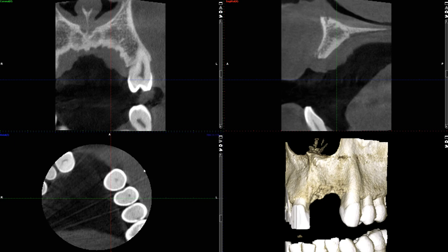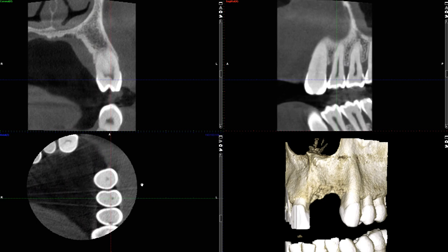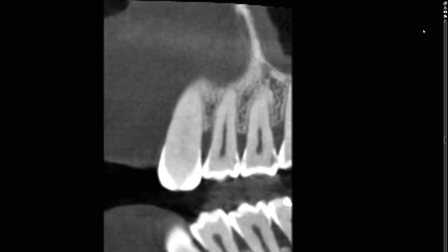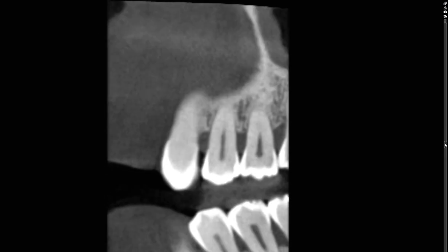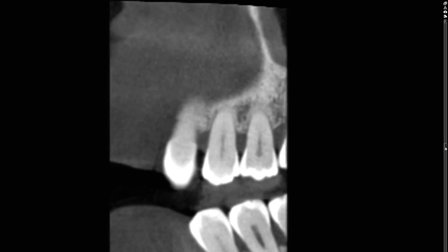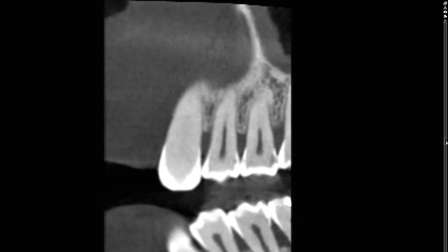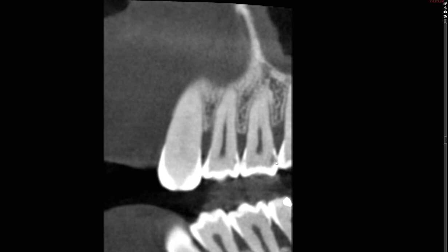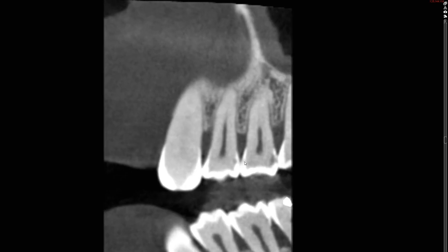Now as I scroll through these corrected sagittal views, can you determine where it is? It should be pretty obvious at this point. If you've answered distal of number 13, you're absolutely correct. There's disruption — or rather demineralization — of the enamel layer, and a radiolucency spreading along the DEJ extending into dentin. If you've also said the distal of number 12, you may also be correct. I'm also suspicious for the mesial of number 13 as well.